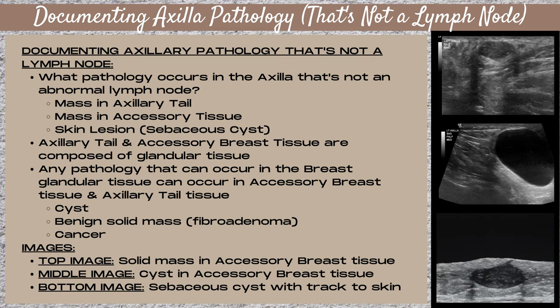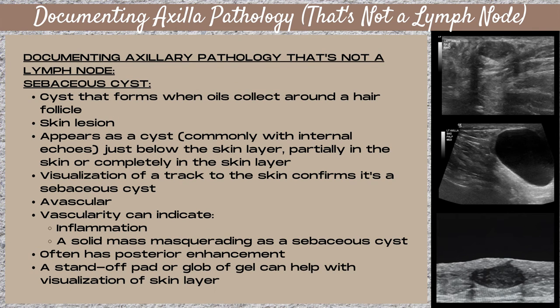The middle image is a cyst within accessory breast tissue. Because the cyst is so large it's hard to appreciate the accessory tissue, but the white glandular accessory tissue is superficial — right underneath the skin line — with a thin rim of tissue around the cyst. The bottom image is a sebaceous cyst, a skin lesion, with its hallmark feature: a track to the skin. A sebaceous cyst forms when oils collect around a hair follicle; it appears as a fluid collection that commonly has internal echoes, located in or just below the skin layer. The thin black line anterior to the cyst is the track of the hair follicle, and visualizing this track confirms it is a sebaceous cyst.